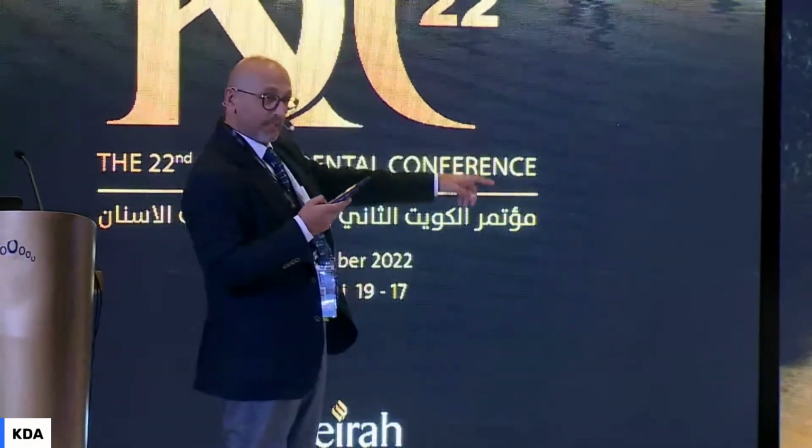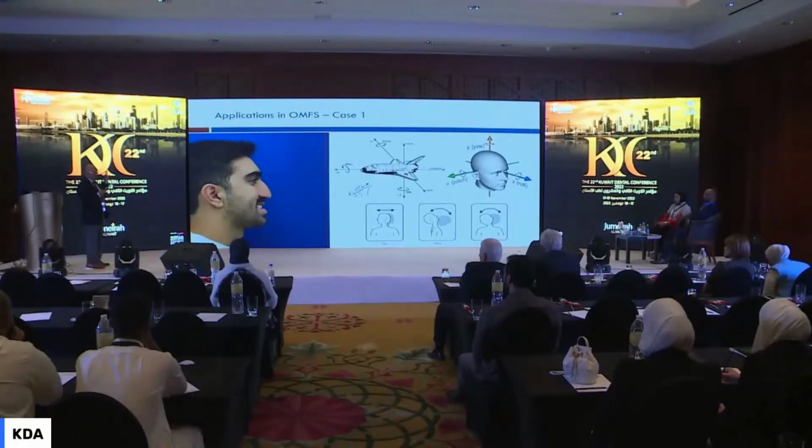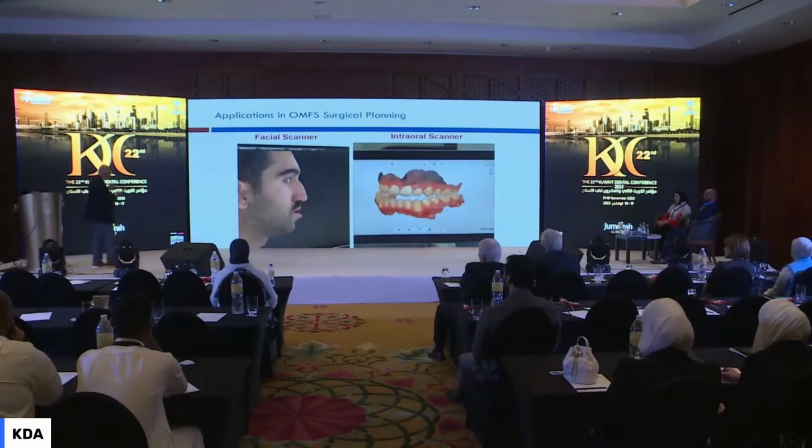But usually the patient doesn't stand like that. But when you find out the natural head position, this is the natural head position which you have to use in order to do the complete planning.